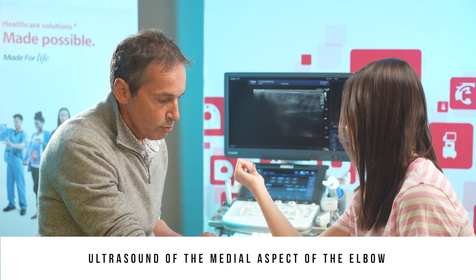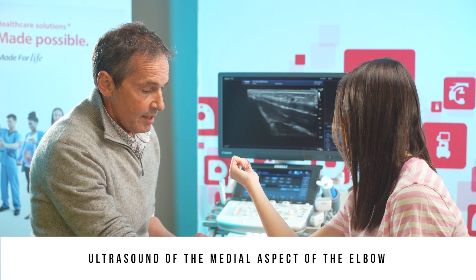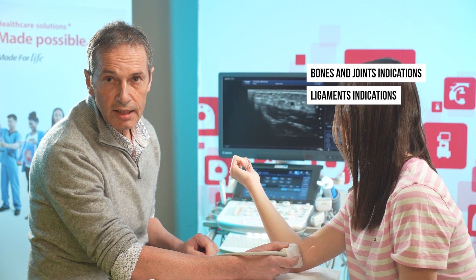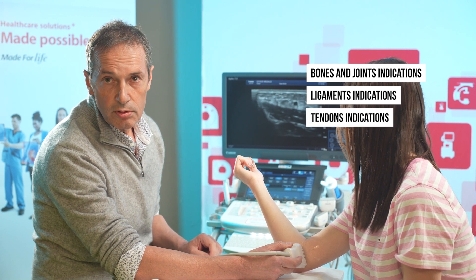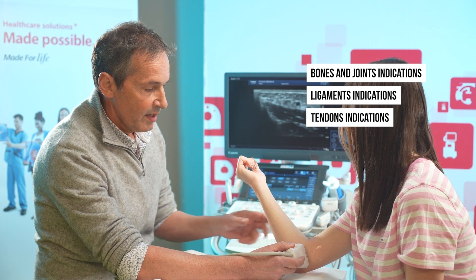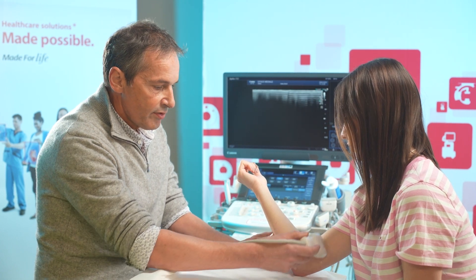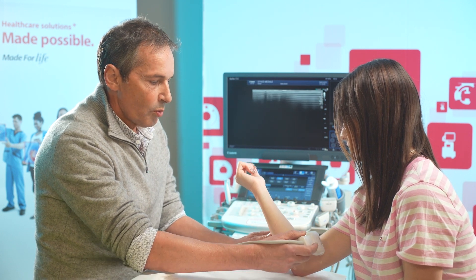Analysis of the medial side of the elbow is used for three types of examinations: bone and joint indications, ligament indications — meaning the ulnar collateral ligament — and tendon indications, thus the tendons inserting on the medial epicondyle. To do this, make sure the patient is in the right position, with the elbow flexed and forearm supinated.